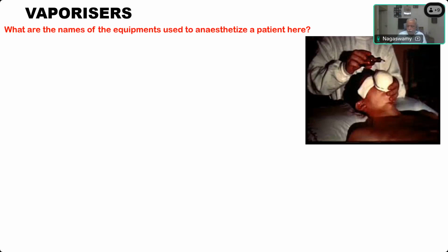What agent are you going to use to anesthetize the patient here? Ether. Okay. So ether, is it a liquid or a vapor? Liquid, sir. It is a liquid. So can liquid be directly poured onto the face? No, sir. So what should happen to that liquid?